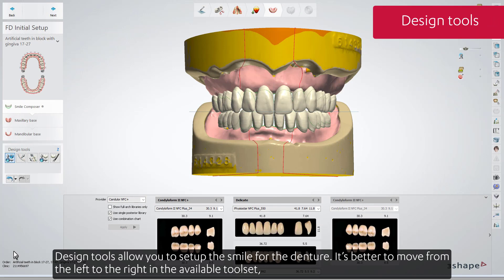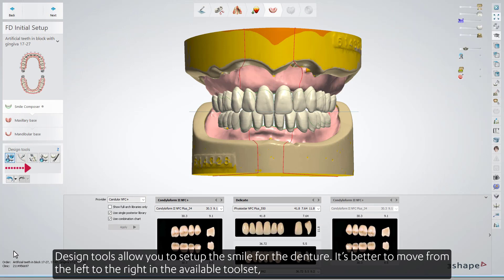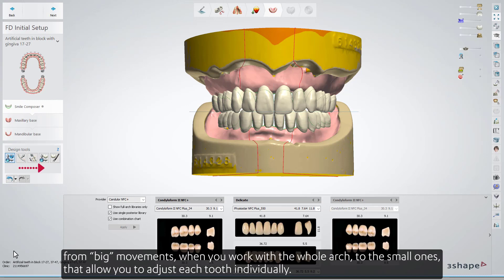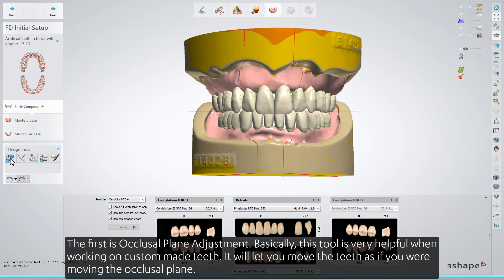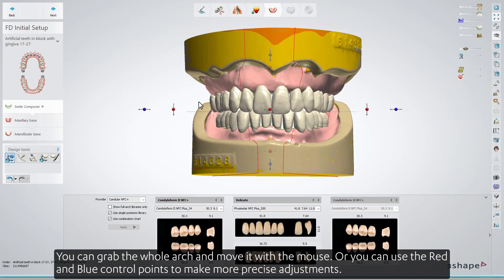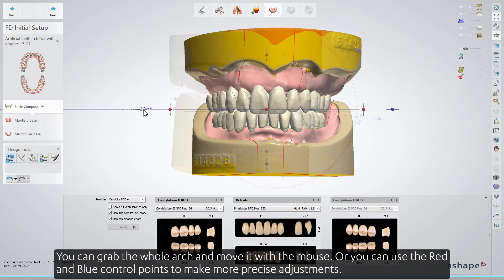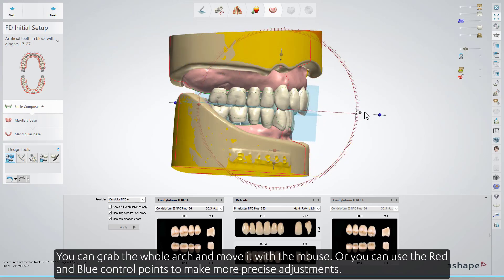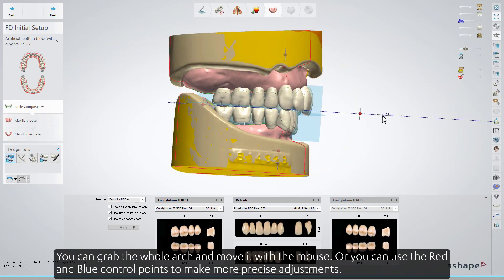Design tools allow you to set up the smile for the denture. It's better to move from left to right in the available tool set, from big movements when you work with the whole arch to small ones that allow you to adjust each tooth individually. The first tool is the occlusal plane adjustment. With this tool you move the teeth as if you were moving the occlusal plane. You can grab the whole arch and move it with the mouse, or use the red and blue control points to make more precise adjustments.